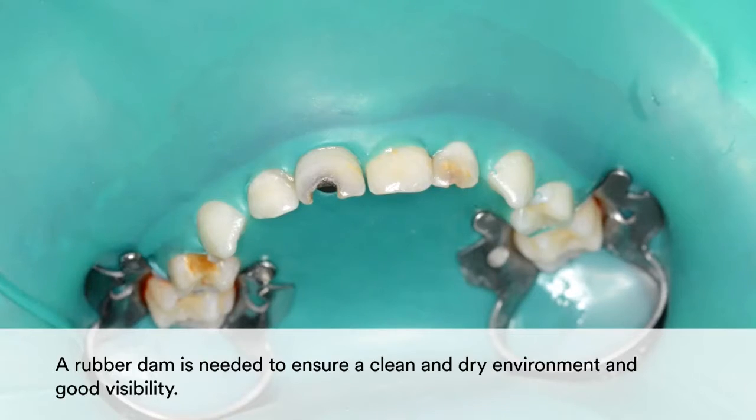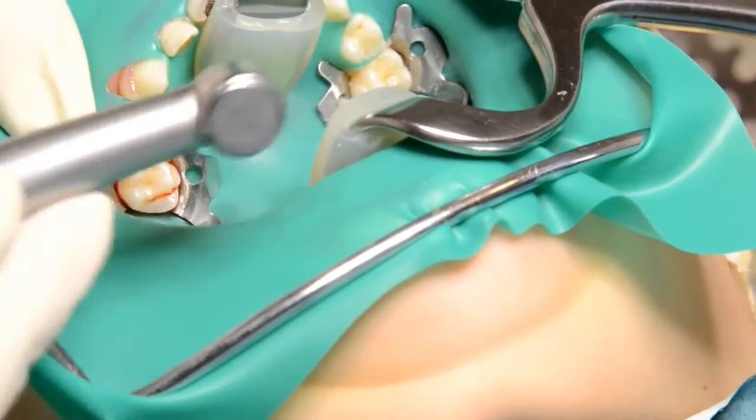make sure to have all necessary materials and instruments handy on your tray. Then place a rubber dam to ensure a clean, dry environment and good visibility.